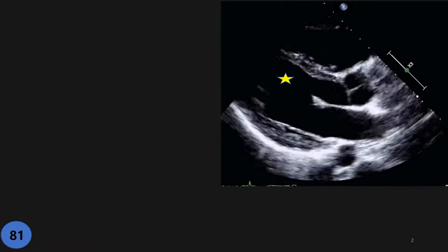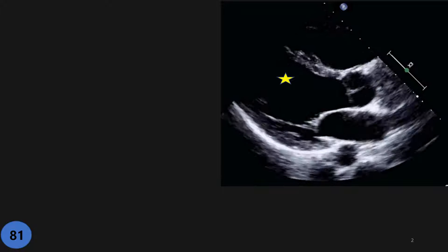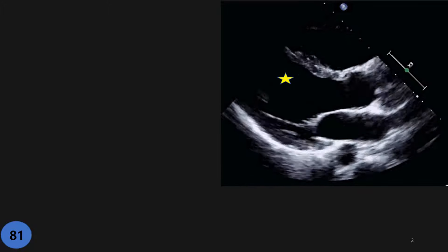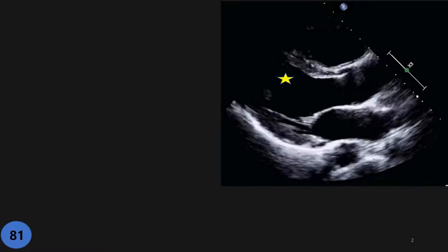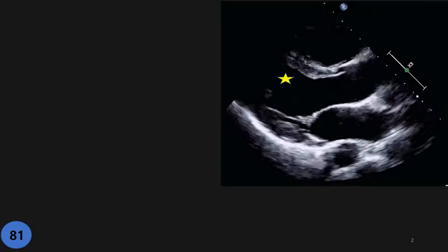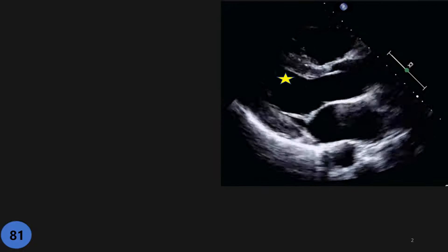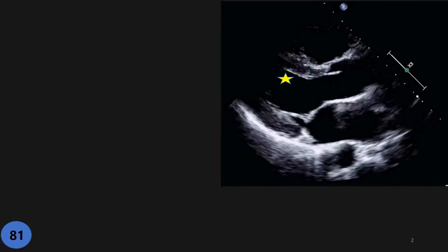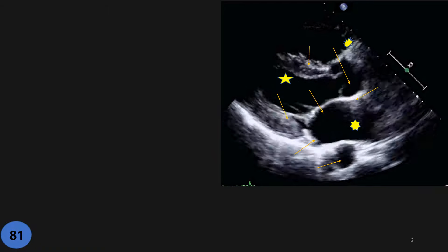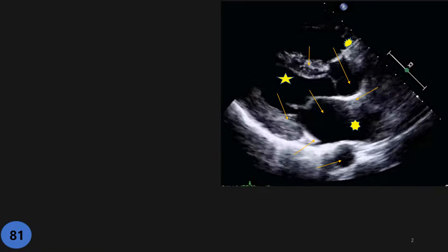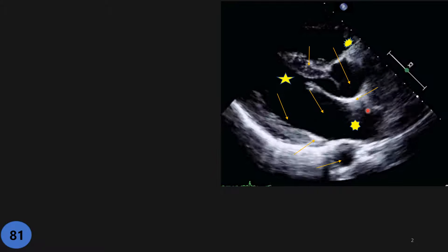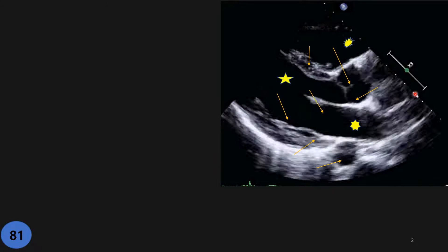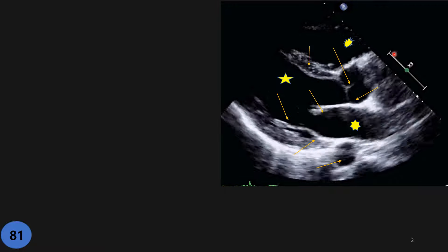Here we have PLAX images and I am going to mark those structures. Let's go together and see how good your anatomy is. Here are the structures I marked. I am going to answer from here going clockwise. Let's go one by one together.